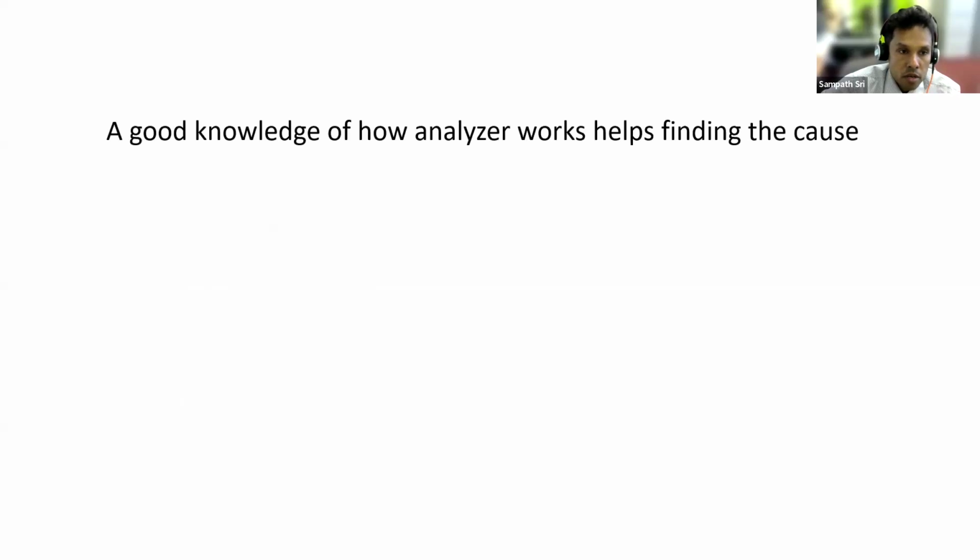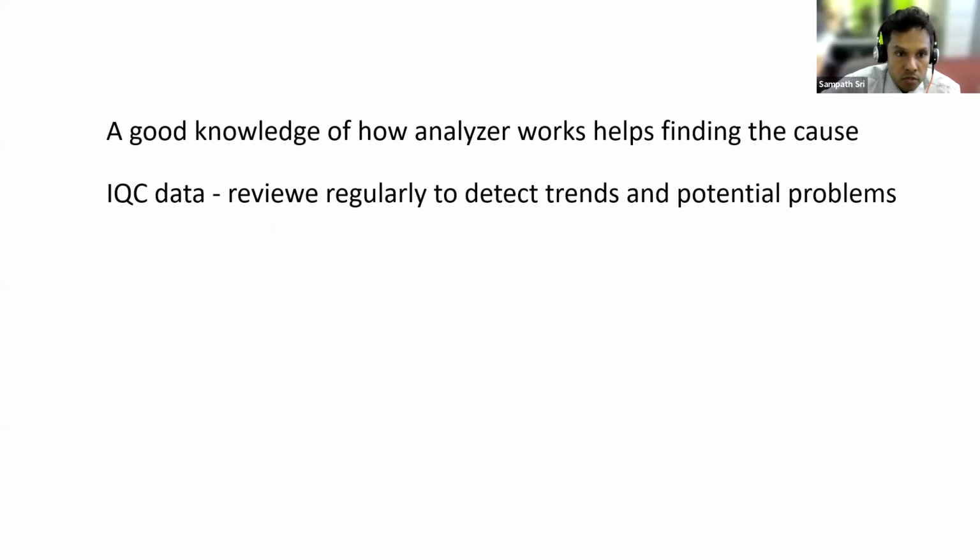So to identify a cause, we should have a good knowledge of our analyzer as well as our IQC data, and we should have a way of detecting potential problems.